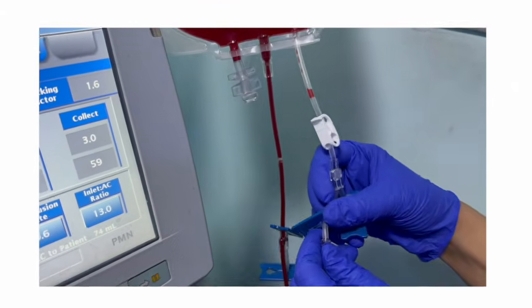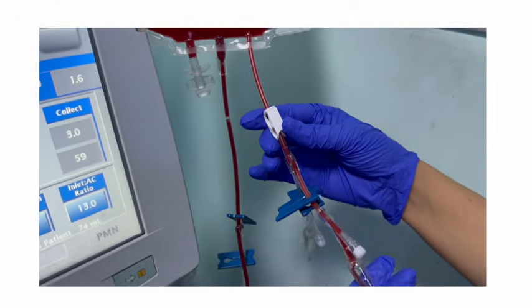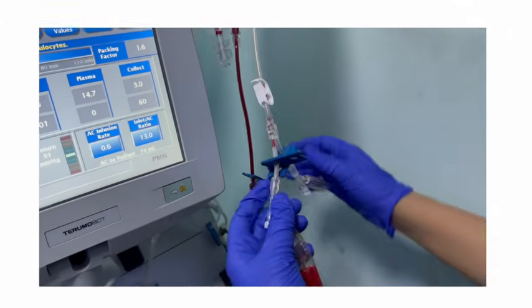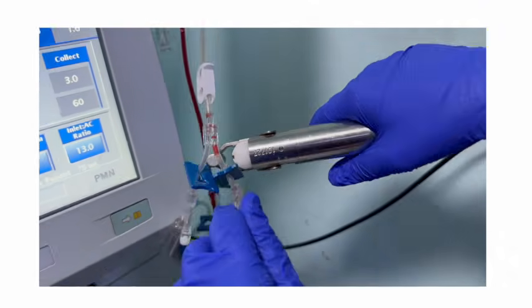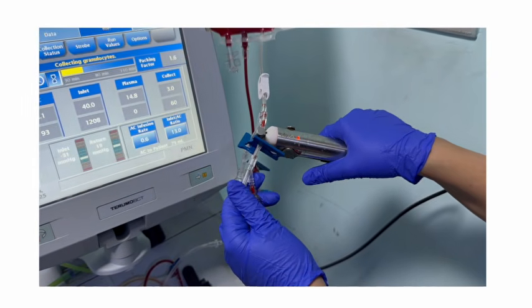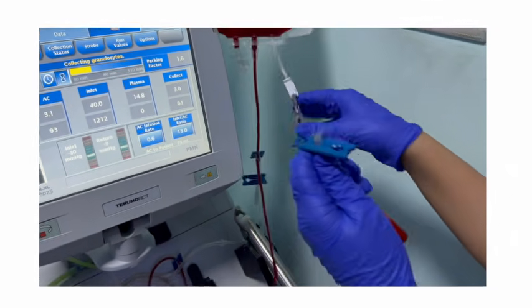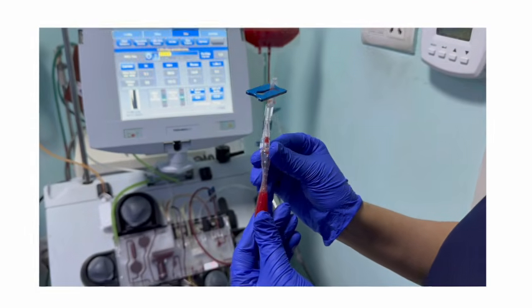After mixing the contents properly, the clamp to the sampling bulb is opened. The bulb is squeezed gently so that about 2 ml of the granulocyte product is collected inside. It is then reclamped, and the sample bulb in which the sample was collected is detached from the collection bag using the sealer. The granulocyte product in the sampling bulb is later transferred to an EDTA vial and the CBC counts are done from the sample.